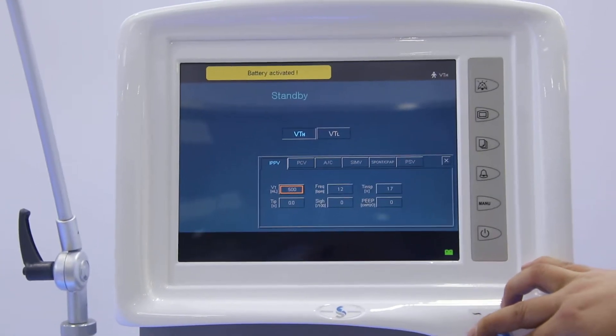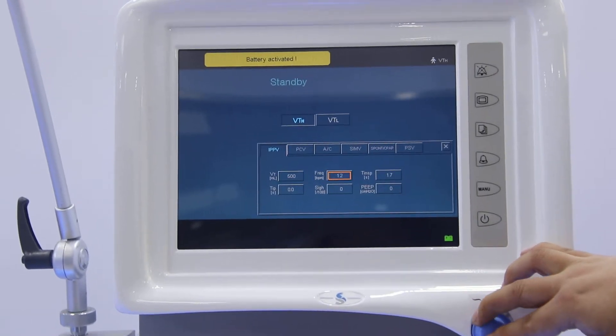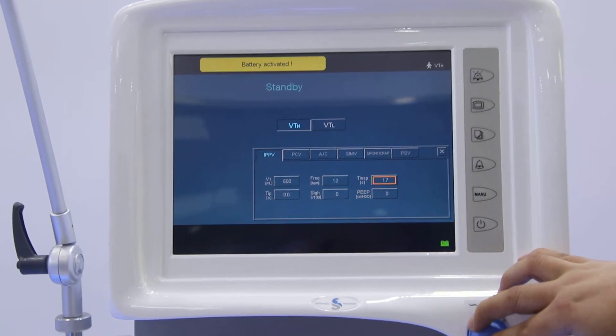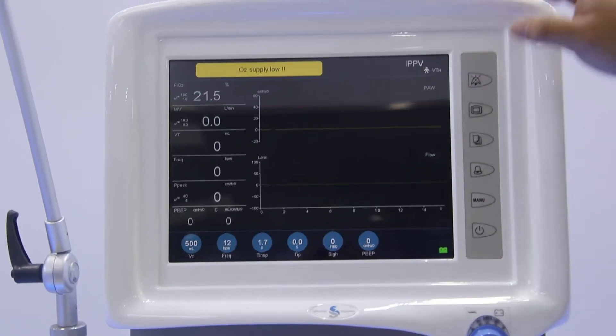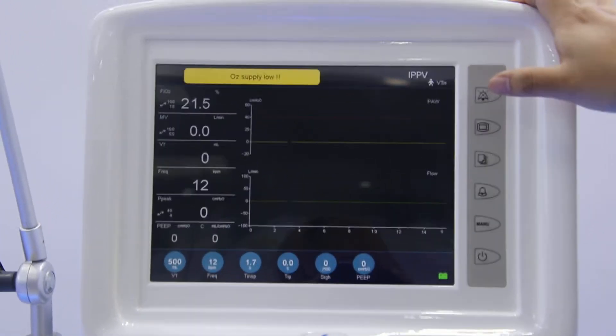And then under each of the ventilation modes, we can choose different details like the tidal volume, frequency, and I:E ratio. Then once we confirm, we will get into the main interface. On the main interface, we have totally four parts.